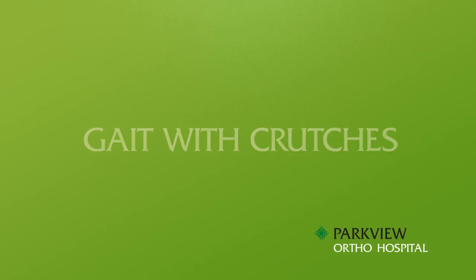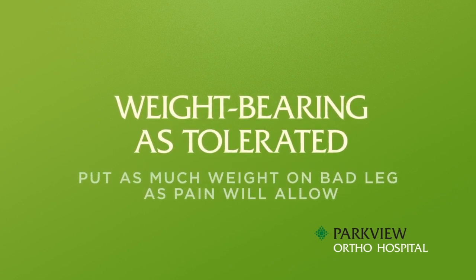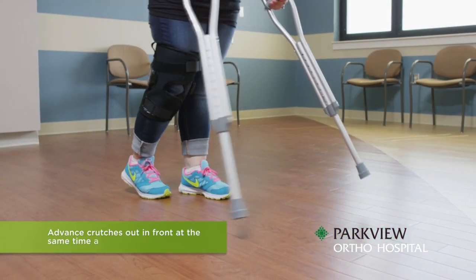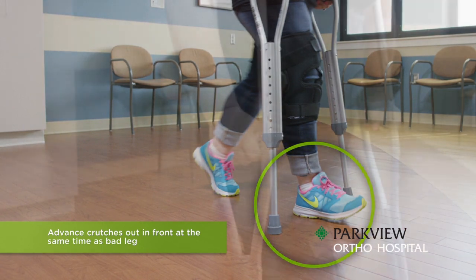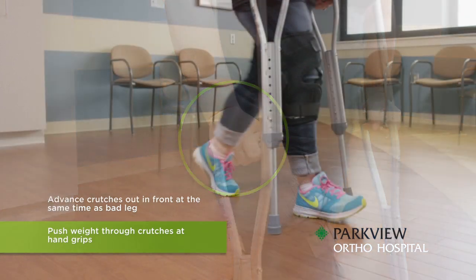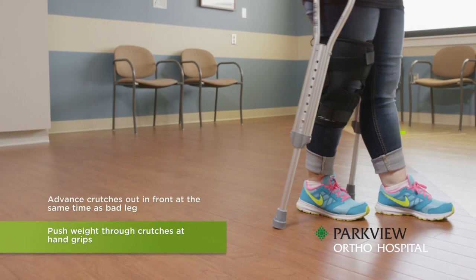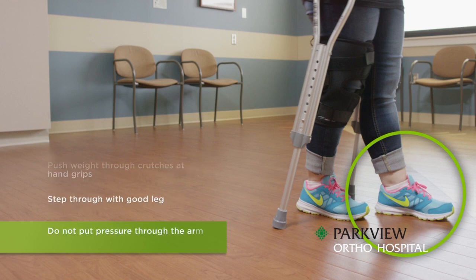Gait with crutches, weight-bearing as tolerated: you should put as much weight on your bad leg as pain will allow. Advance your crutches out in front of you at the same time as your bad leg, and push your weight through the crutches at the hand grips. Then step through with your good leg. When doing this, remember no pressure is to go through the armpit.